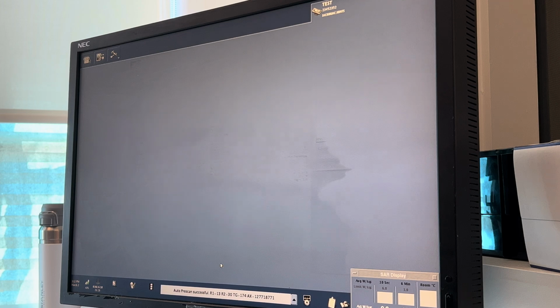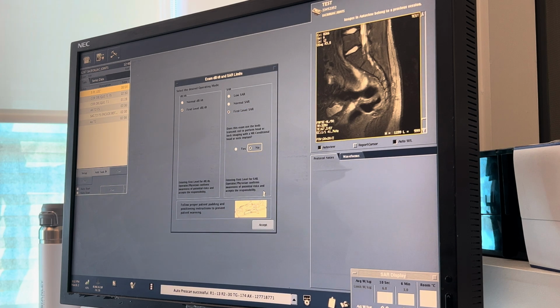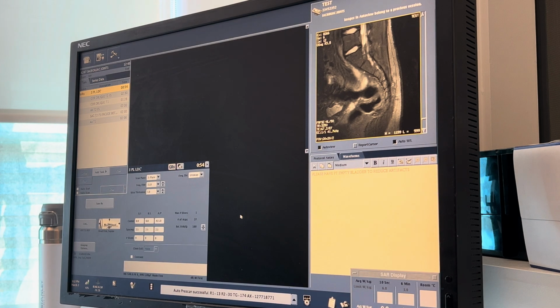So the reason is because the axial T1 in the sacroiliac joints is just a conventional spin echo pulse sequence, so it takes like 10 minutes. And this one is much faster. It's like 2 minutes. Okay, so get something going.